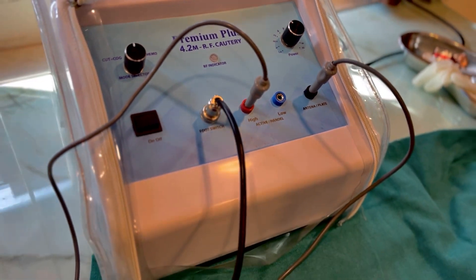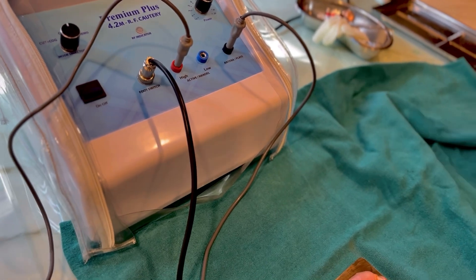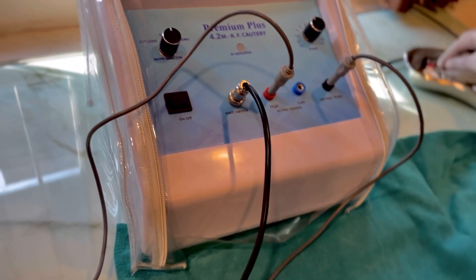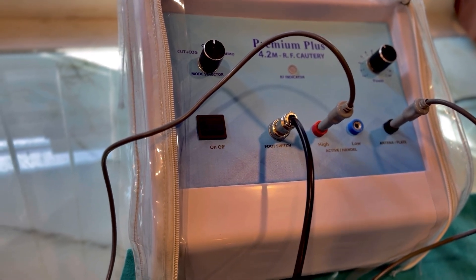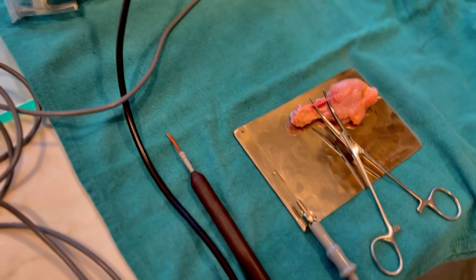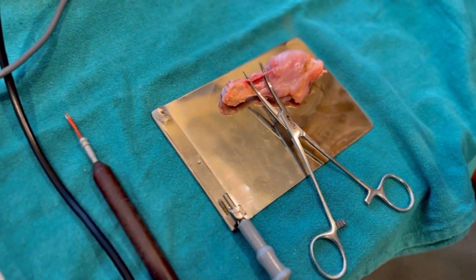Assembly and setup of the electrocautery unit is out of the scope of this video, but you should know how to assemble your electrocautery unit. Now focus on what we are going to do here.